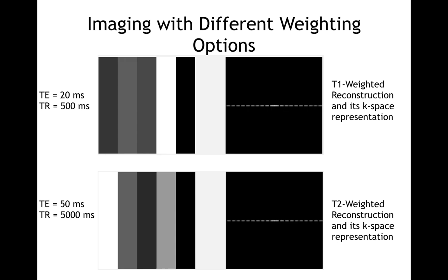On the other hand, although proteins have a T1 constant equal to that of fat tissues, their signal intensity is very low because of their extremely low T2 value. The signal coming from the proteins decays immediately because of the small T2, and proteins are going to appear darker no matter where the emphasis is on the imaging.